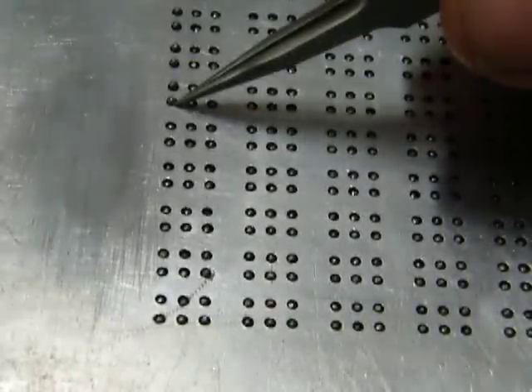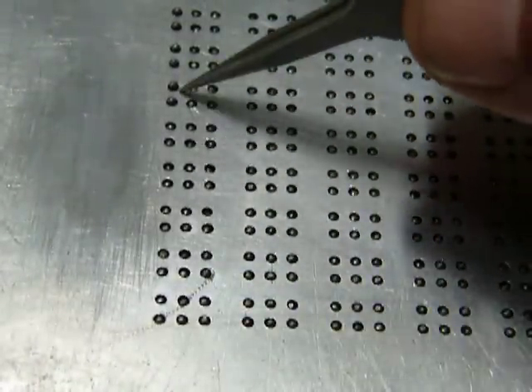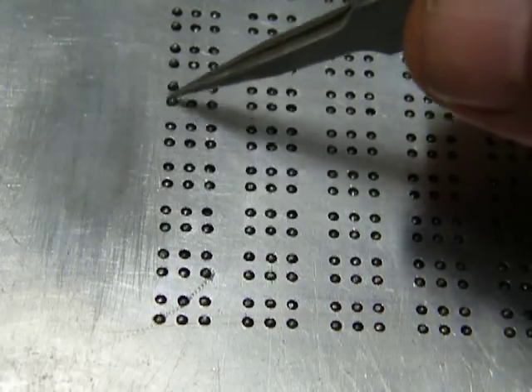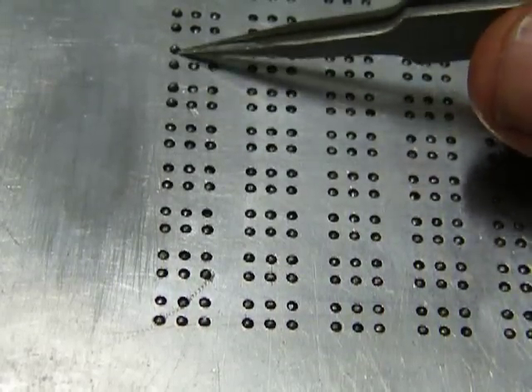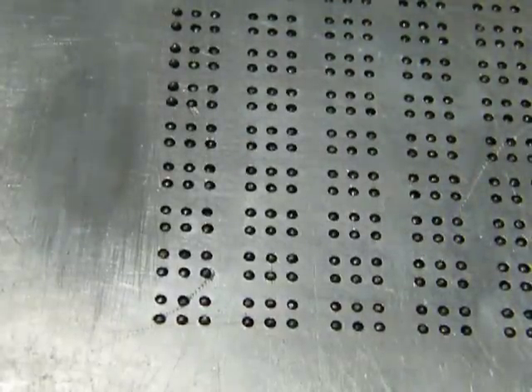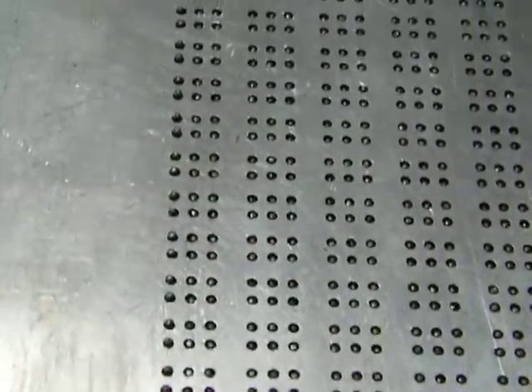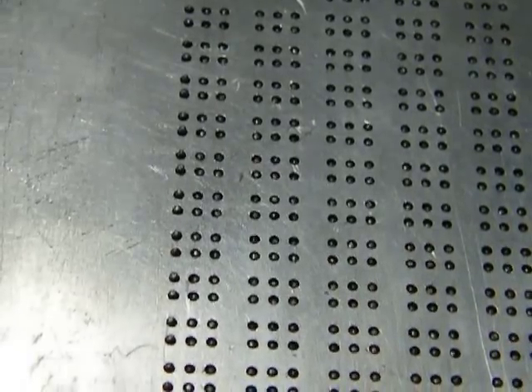I'm zooming in slowly. Okay, that's cell 1, 2, 3, 4, 5, 6 onwards. So six, can you see the pins coming up? Six, seven has got pins up there and right through the whole line. I'll try and show you the line. All the cells are up for the line.